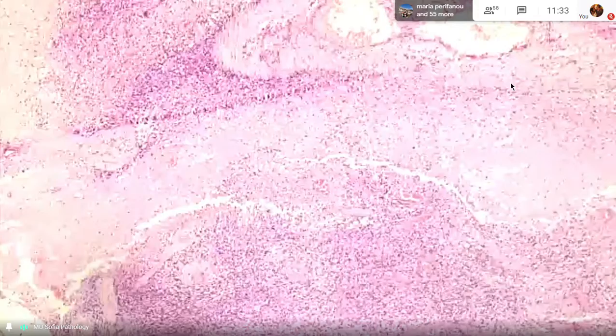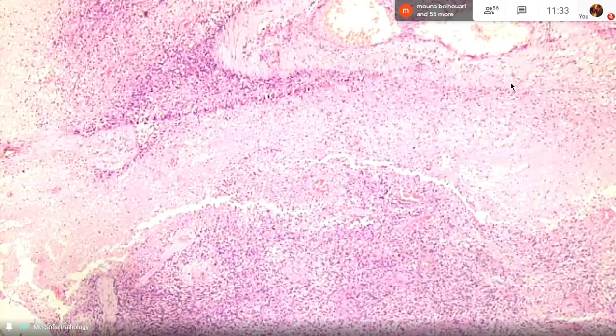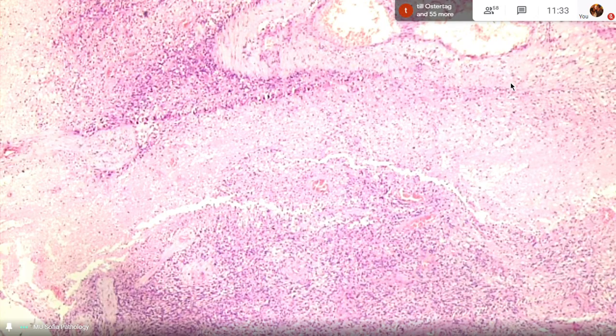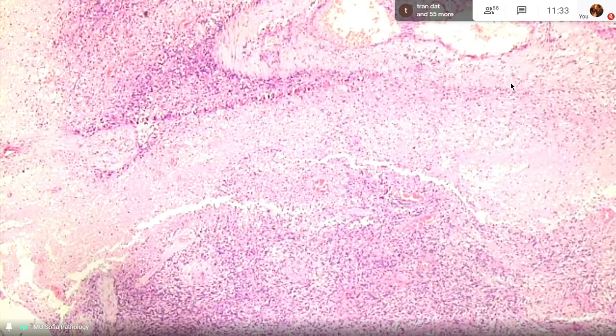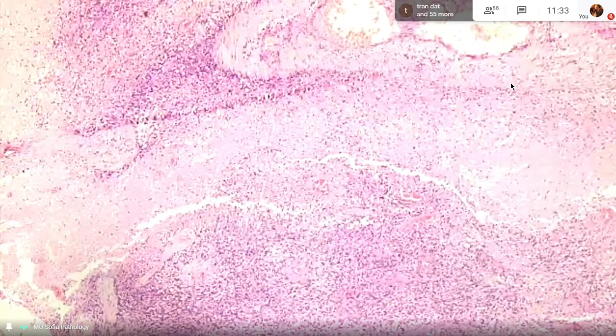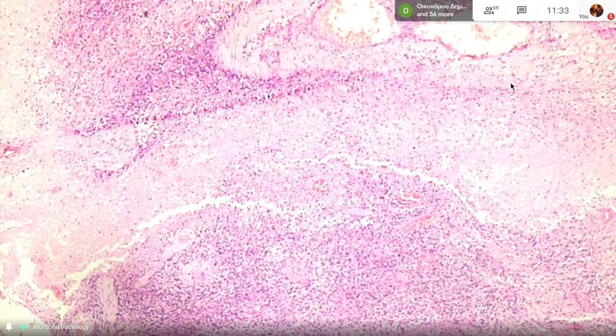Yes. So you are alarmed because of the pleomorphism of the cells, and you have a necrosis. And in some areas, you have also hemorrhages, like on the right part of the screen. Okay, so you suspect a malignant tumor. What is difficult for the exam is to recognize that this malignant tumor is really a brain tumor. This is the problem for the students, and how to recognize that this is glioblastoma multiforme.